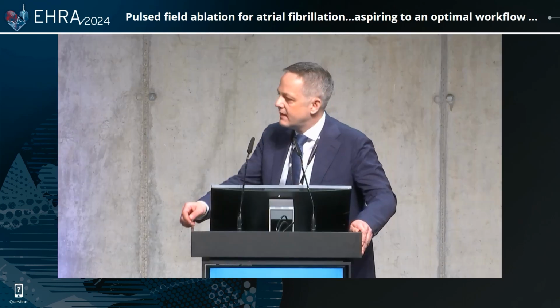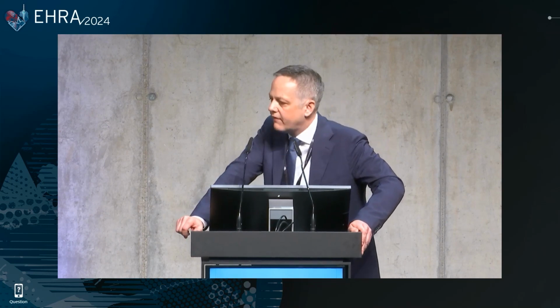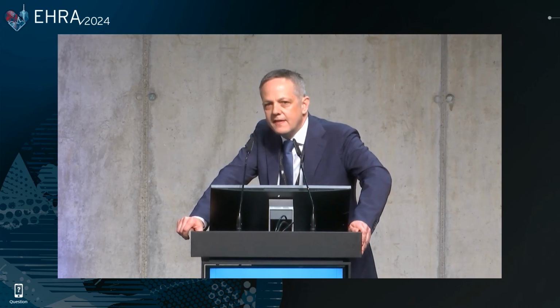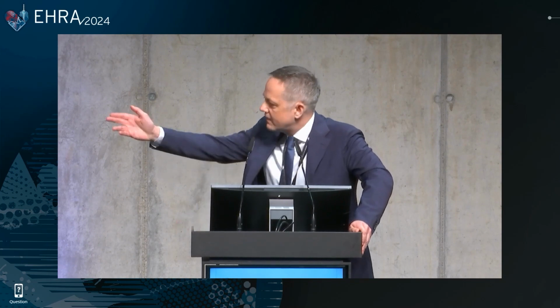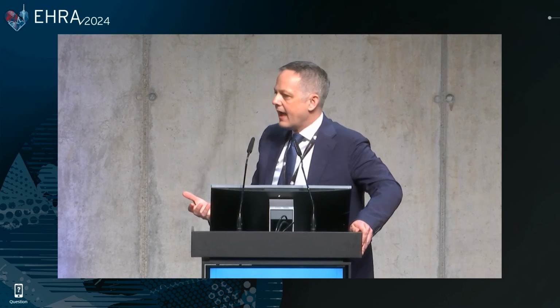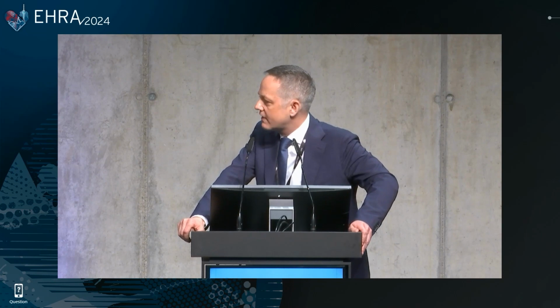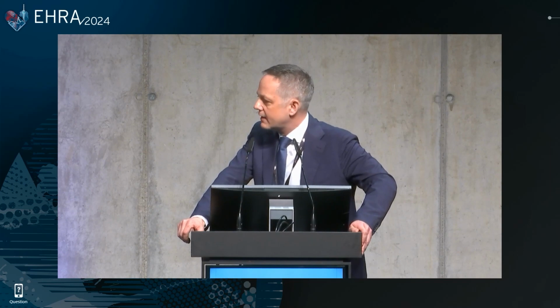Well, I think this is an important question because pulmonary vein isolation or durable lesions are important to all of us, and most of all to our patients. So what I think, number one, PV reconnection is still an issue, also in the era of PFA. Number two, I think, because it was discussed before, Jose, my feeling as a clinician is that tissue contact is important, and you really have to give credit to investigators and centers that use, for example, ICE already in the single-shot era to assess for tissue contact. And actually, this single-shot device has triggered us to use ICE from time to time, also in our cases, to assess for contact.